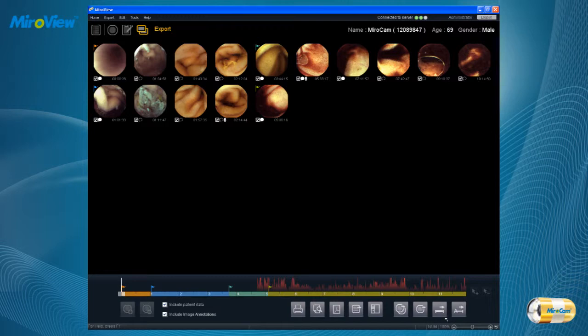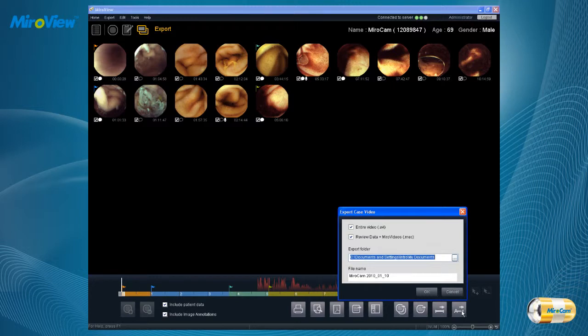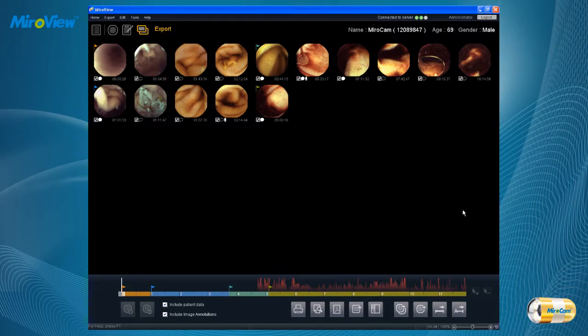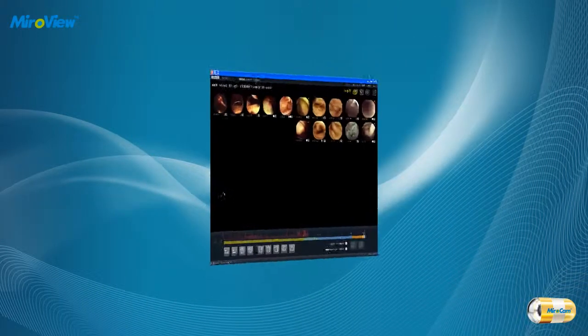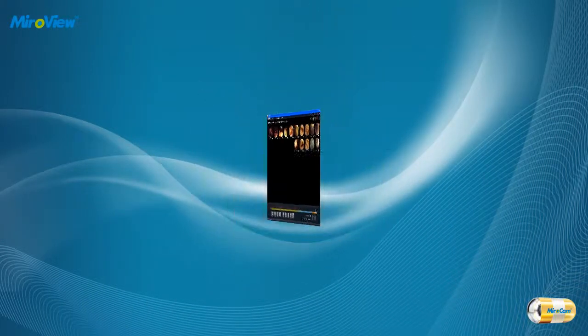If no segment is selected, the export segment button will be disabled. Click on the Export Case as Video icon to export the entire file as video or MiroView. For detailed usage of MiroView Client, please refer to the MiroView user manual. Thank you.